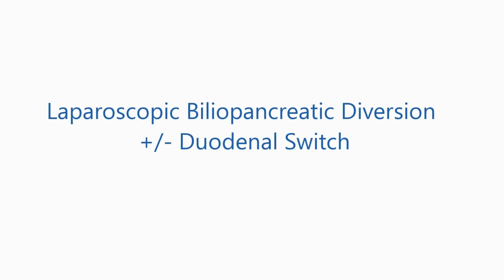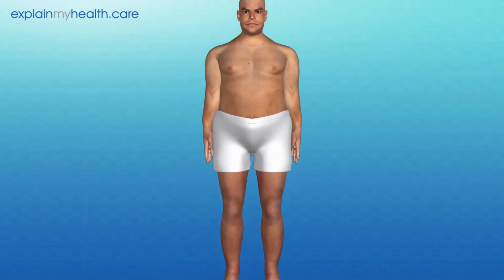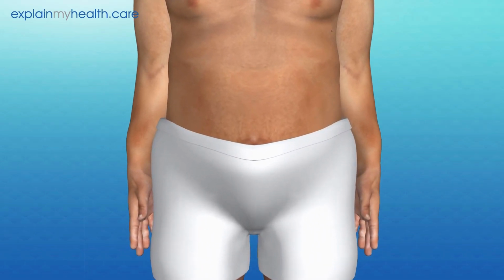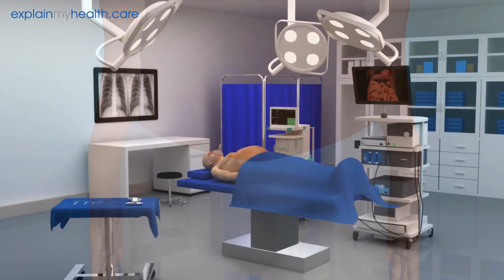During this video, we'll explain what's involved in a laparoscopic biliopancreatic diversion, or BPD. This is a weight loss procedure which has a number of variants. The key principles are demonstrated here, but it can vary depending on your personal requirements.